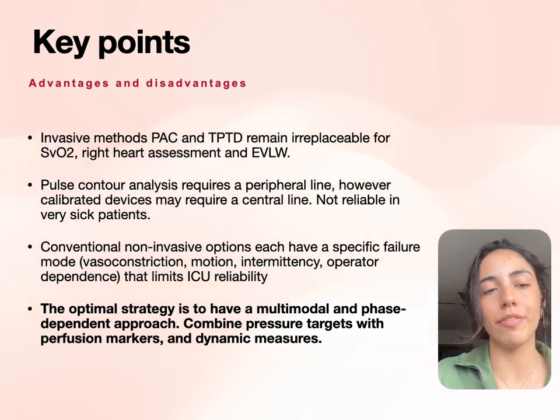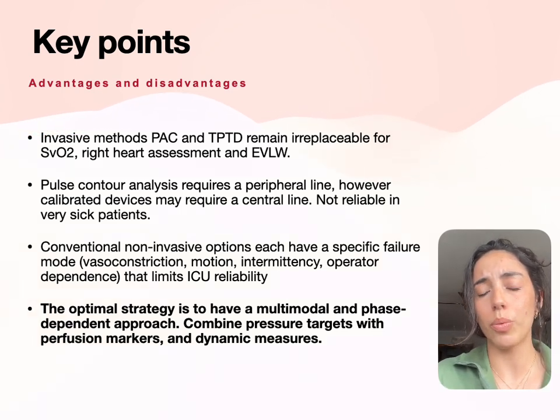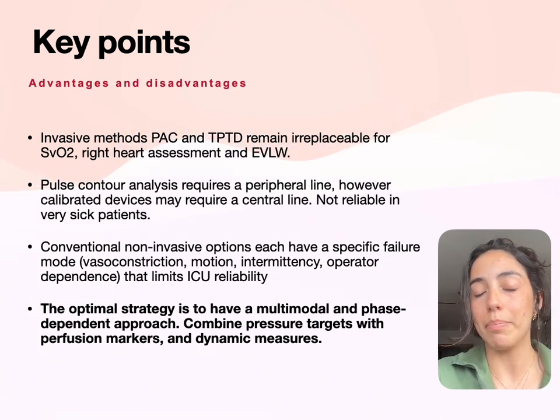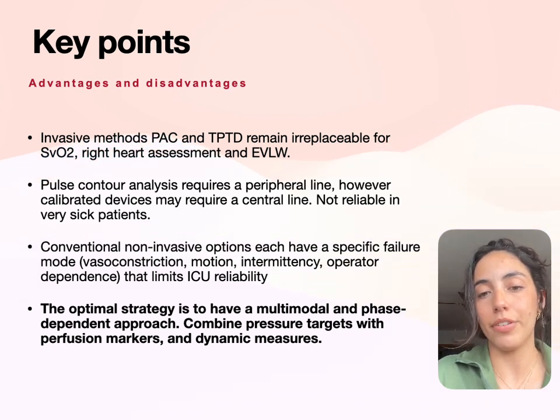In terms of conventional non-invasive options, we can rely on electrocardiometry, bioreactance. However, the ones that rely on pulse contour analysis, for example, may be a little bit more unreliable when there's vasoconstriction, in the case of bioreactance and bioimpedance. When there's motion, they may give intermittent answers, and if anything is disrupted within the signal capturing, we're not going to be able to gain insight into a patient's hemodynamic status in that moment.